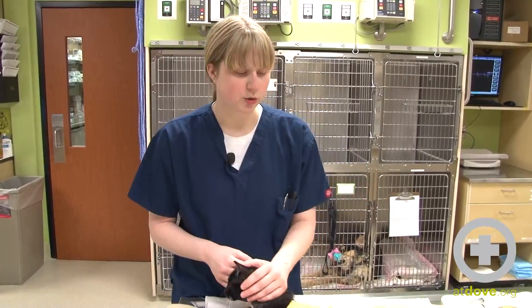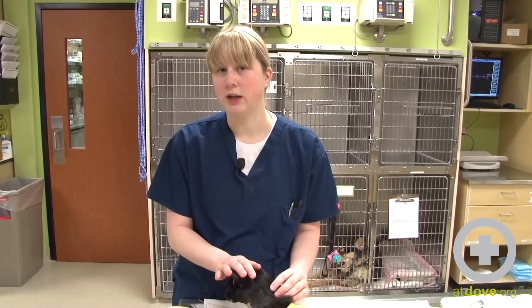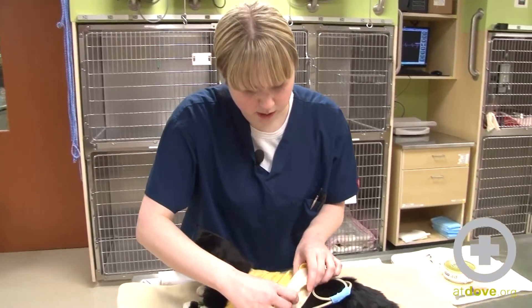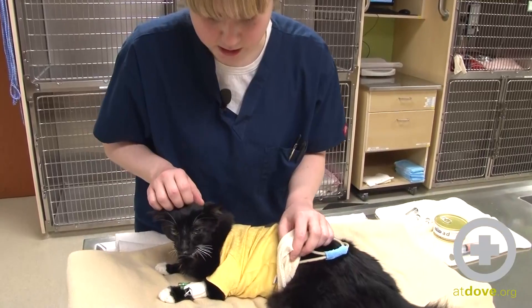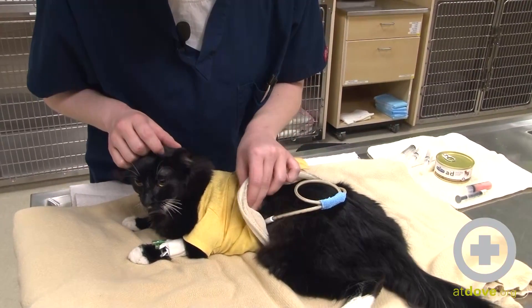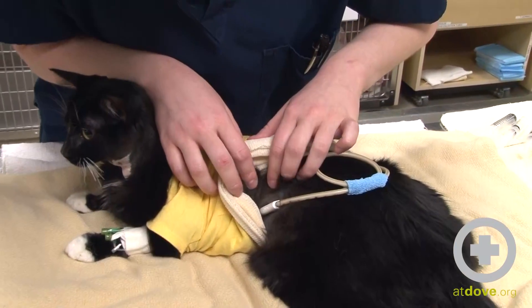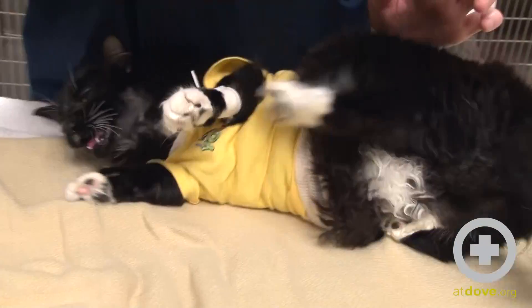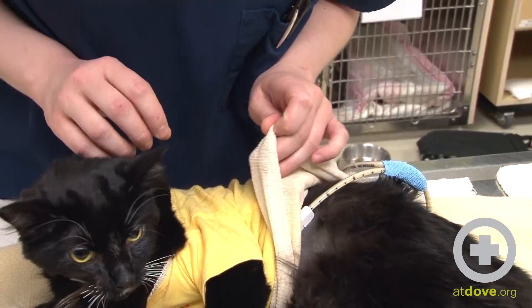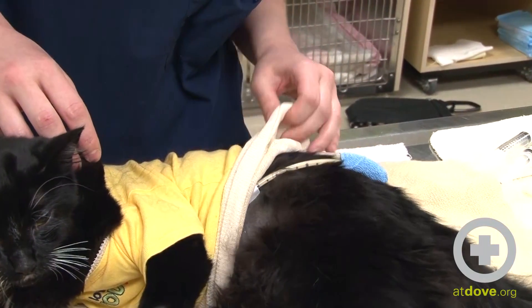What we're going to do first is check the tube site to make sure that there's no leakage or any evidence that it has come displaced. We have a stockinette covering our kitty's spot here to keep it from getting dirt and from being dragged around or pulled on. As you can see, the site looks nice and dry. She is a little sensitive about it, but there's no evidence of any leakage, so it looks good on that end.